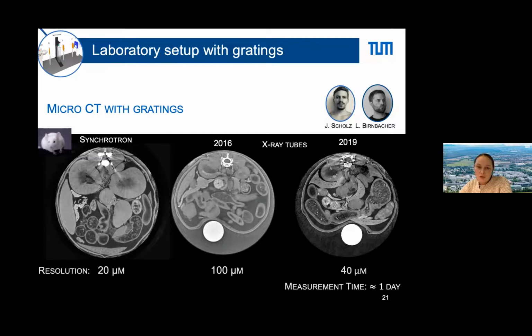And this you can overcome. So at the synchrotron, we are now applying this 2D grating. So we do not use any gold gratings anymore. We just use one phase grating. And this is very easy to create for rather low energies.